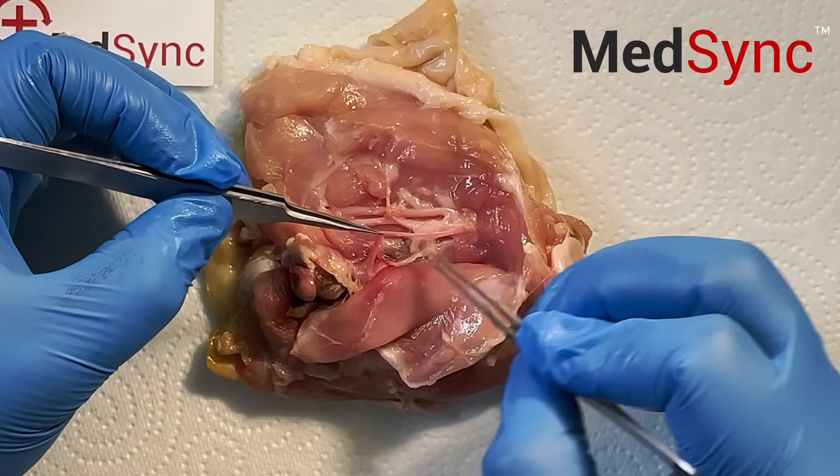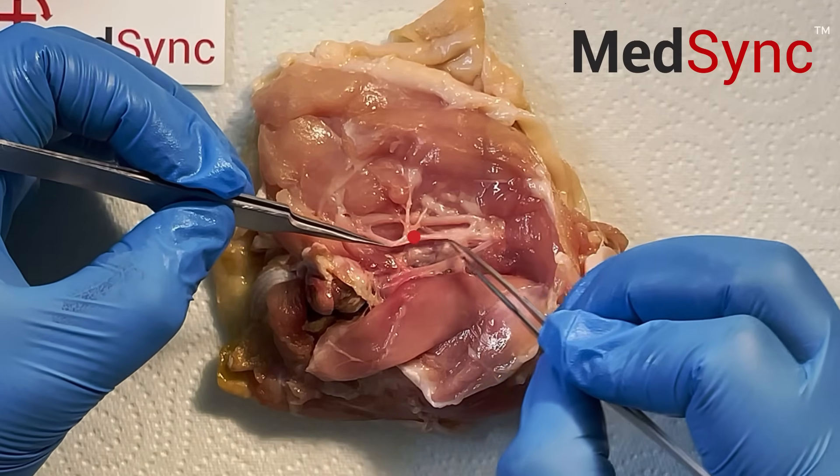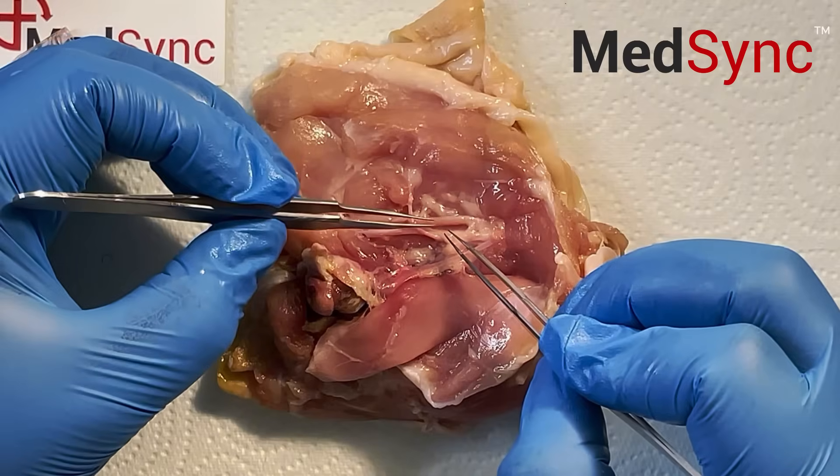This is the vein — you can tell because it's thin. You have the artery, slightly thicker, and then the nerve.